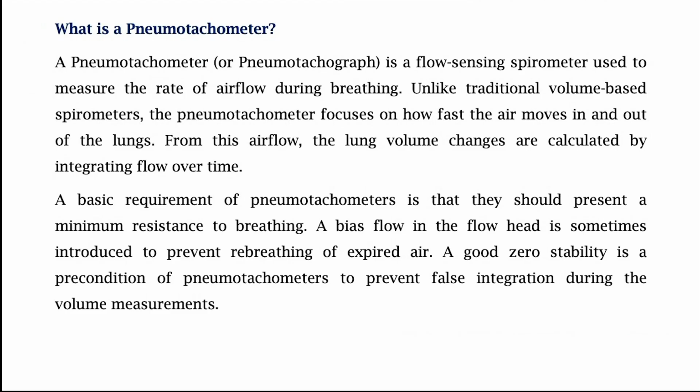Of course, this is essentially an example, but the rigorous method involves a mathematical relationship that is founded on fluid dynamics. Too deep for this course. This is a course on biomedical instrumentation. So when the flow is laminar, the pressure drop is linear to the flow rate. So that is the point.